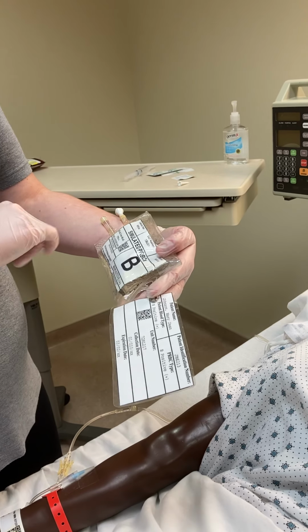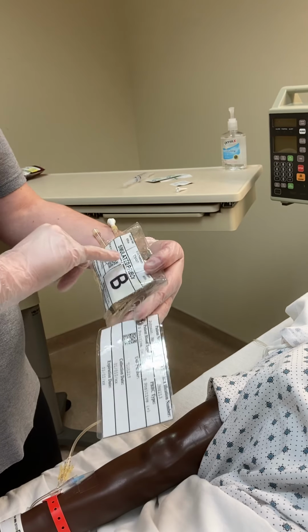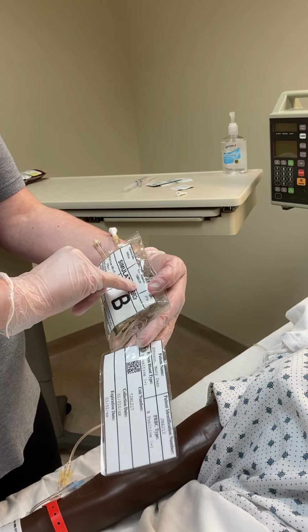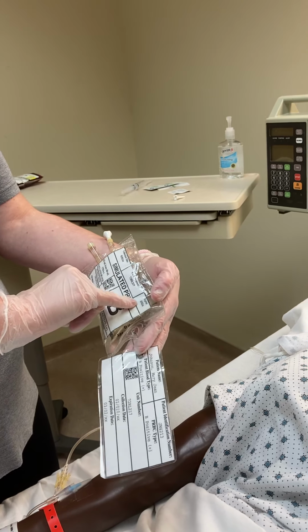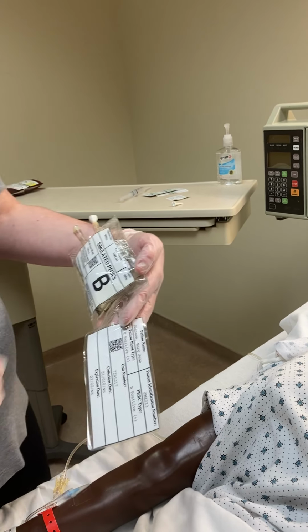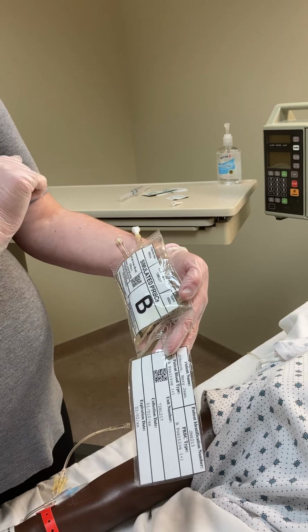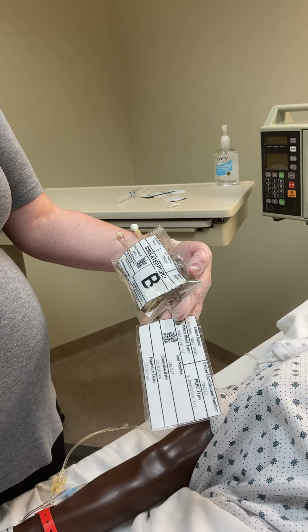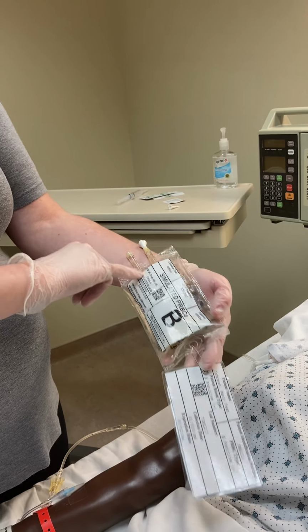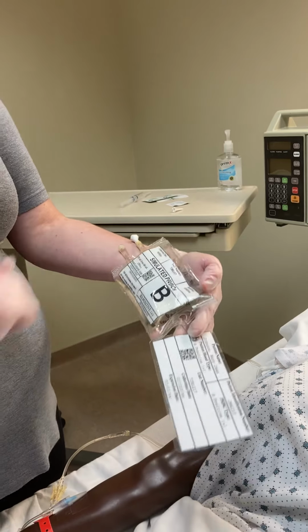Our unit number is 72RL217, and that matches 72RL217. It expires 3/2 of 2021, and it was collected on January 1st, 2020. And we know that we have 325 mLs in here from a volunteer donor.